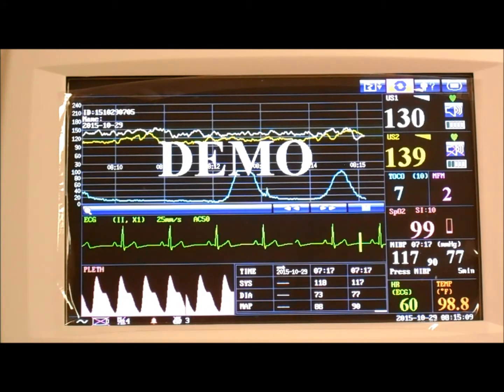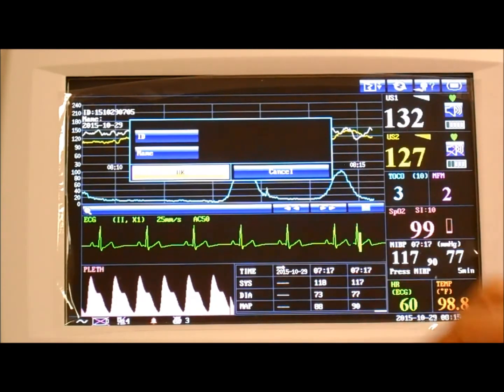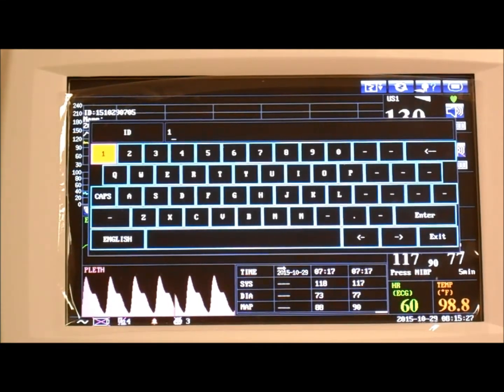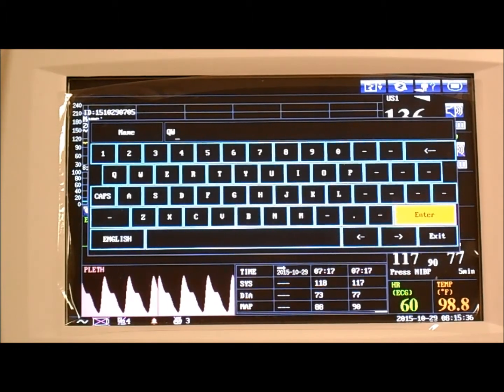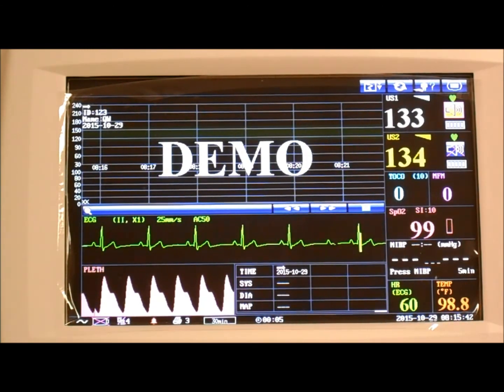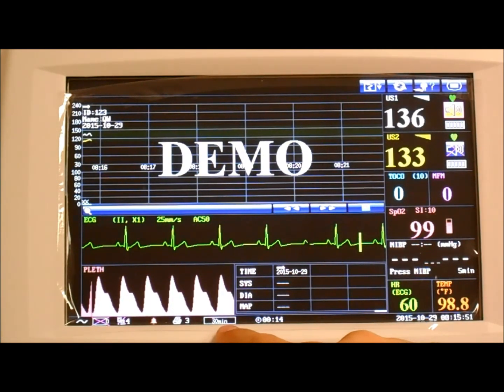So now that you have your sensors connected to your patient, we have the numerical readings, and we want to start or refresh a setting. So we press start, the monitor is cleared. The monitor will give us this indicator to remind us to enter the ID. 1, 2, 3. Enter name, QW. We press enter. Okay. So now the monitor clears for a second, and you start a brand new session. Now you have the name of the patient, the ID, and the monitor begins to automatically print. So it'll go for 30 minutes because that's the setting that we set.